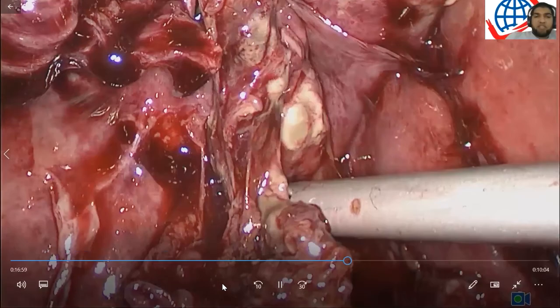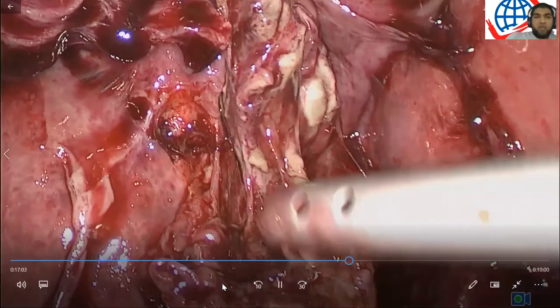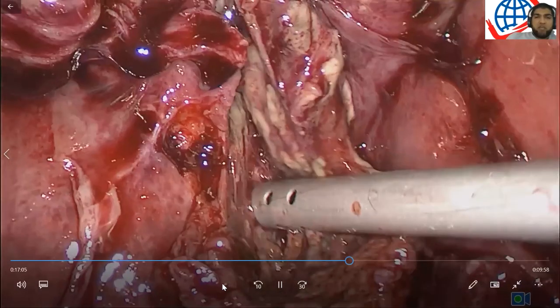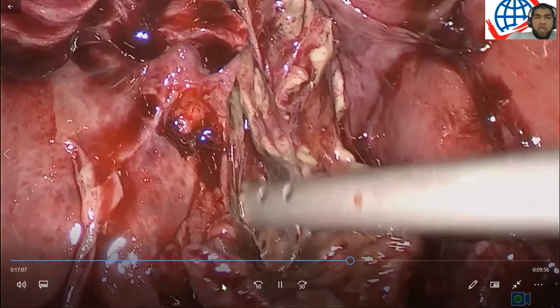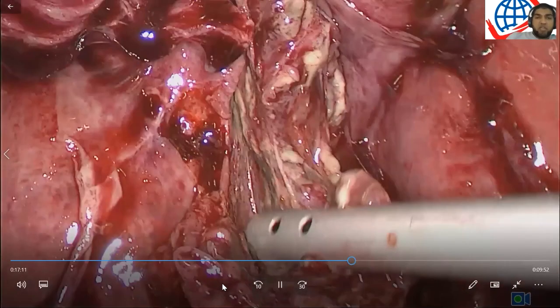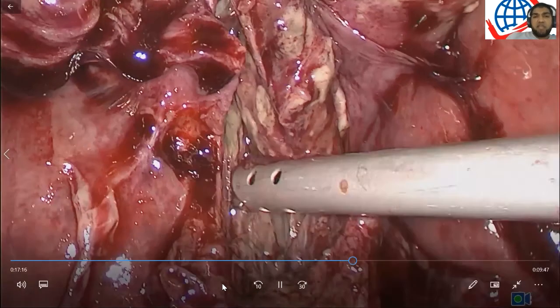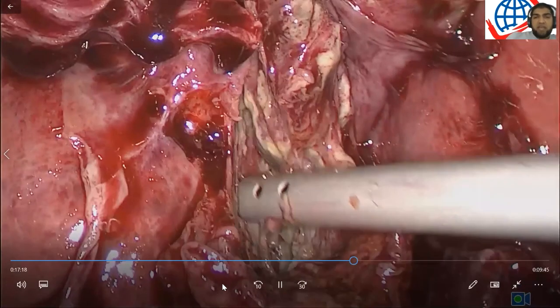Guys, so we haven't clipped the cystic duct yet, but we can see that there's just a little bit of tissue left to dissect now. And we can see that it would be easier at this point to try and get around it. So we're trying to just clean out the front. We assume that the cystic duct may be in here, but this is really damaged anatomy.